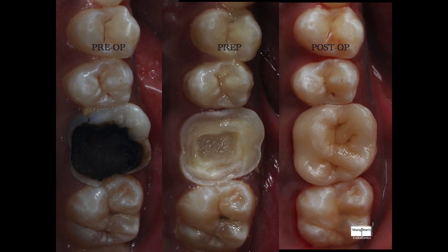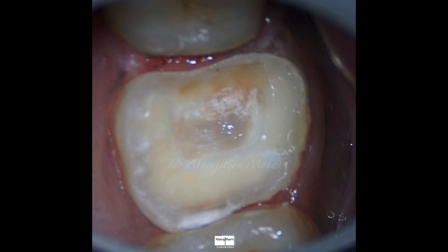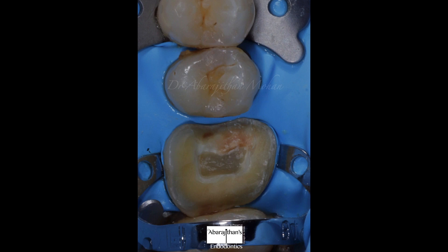Now, do all indirect restorations require deep margin elevation? The answer is no. Every time your margins are already supragingival, we don't need to elevate the margin — it's as simple as that. You can see a scenario here where the margins of this preparation are supragingival 360 degrees, and hence we don't need to do deep margin elevation. Another situation following endo, we can see the gingival seat is pretty supragingival even after removal of unsupported enamel. This is the final preparation and it's still supragingival. I'm able to record the margins well and isolate by placing rubber dam and inverting my dam even without deep margin elevation. These are cases where we will not require deep margin elevation.